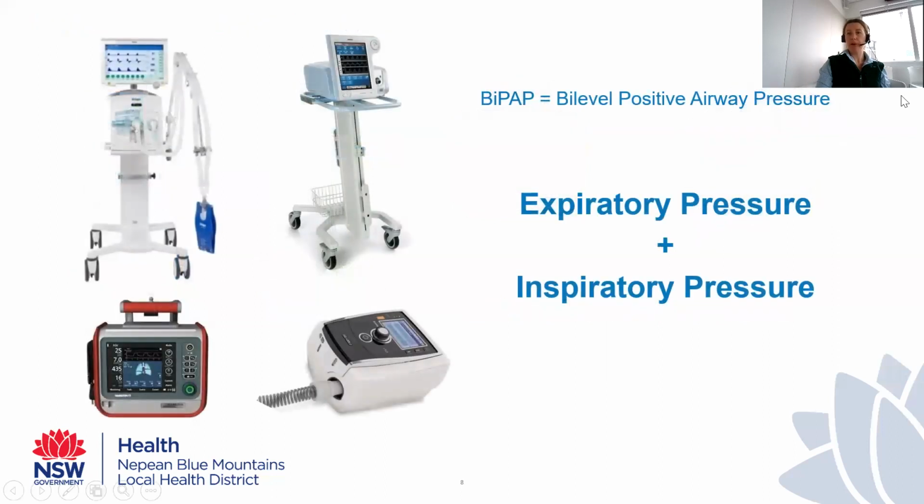BiPAP stands for bi-level positive airway pressure. So this is a mode of non-invasive ventilation where, again, we are applying an expiratory pressure, so a pressure at the end of expiration. But on top of that, we're actually adding a pressure when the patient breathes in. So as the patient breathes in, we're applying a positive pressure, and it makes it easier for the patient to take a bigger breath. So it's bi-level, it's two-level.